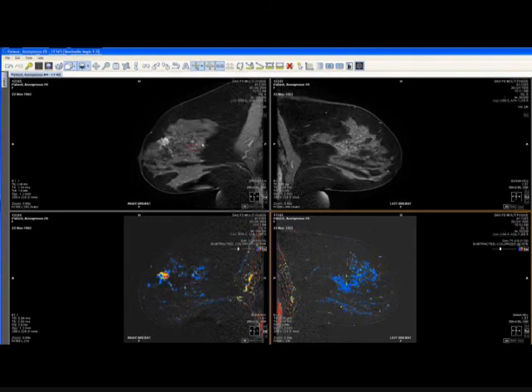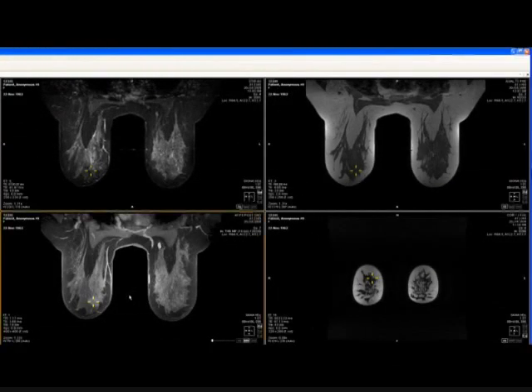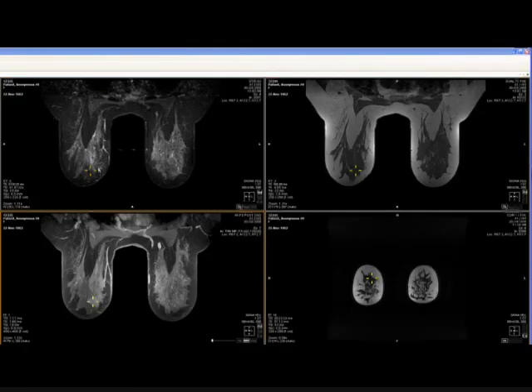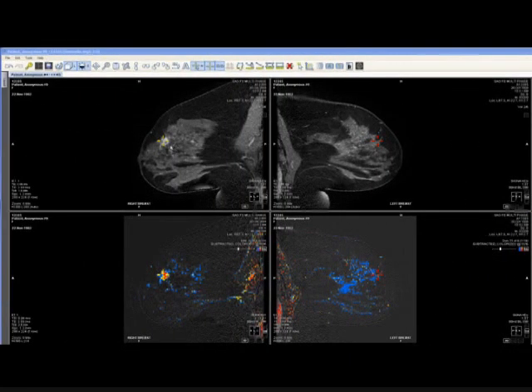Just for the sake of a further evaluation, if we cross-correlate these, here you can see on the delayed exam, this abnormal enhancement with the delay, you've lost some of the morphology as the lesion has started to wash out and the margins become less distinct. This is clearly not T2 hyperintense, not that that would matter given this morphology and the enhancement characteristics of this.